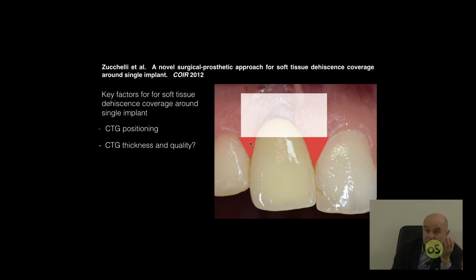Remember that this papilla does not have bone intact below because it's implants, it's not teeth. This papilla comes mostly thanks to the conditioning effect of the crown, so they have been squeezed by the temporary and by the definitive crown of the previous dentist so that they can achieve a triangular shape, feel the interdental contact, but they are most considered false papilla in terms of blood supply because they are triangular, mainly made of epithelium with a very, very poor core of connective tissue.